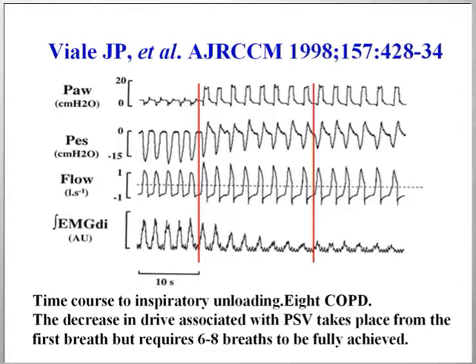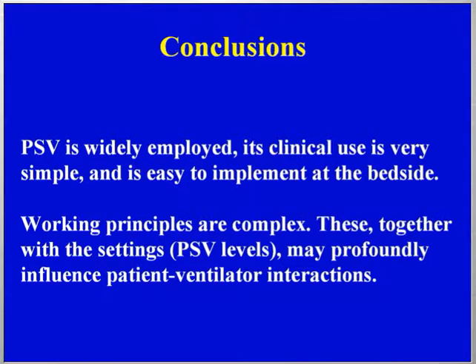So just to conclude, pressure support ventilation is a widely employed mode. Its clinical use is really very simple, and it's quite easy to implement at the bedside. And this is good news. Nevertheless, the working principles are very complex, and this, together with the settings, the proper adjustment of the levels of assistance, may profoundly influence the patient-ventilator interactions. Thank you very much.